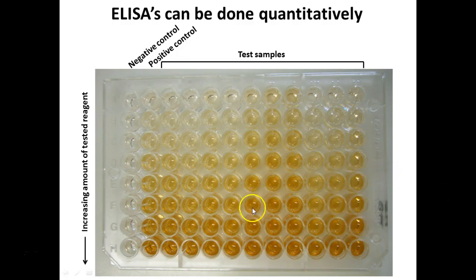So you can see these samples down here are really positive, right? And some up in here are positive. Some of these are probably negative because they're really light. Does that make sense? And again, for some of these tests, for us, we looked for 700 or higher as a good, strong positive. Less than that, we didn't consider it positive. And I would get values like 1,000 when they were really far along in the progression of the disease of having leprosy.